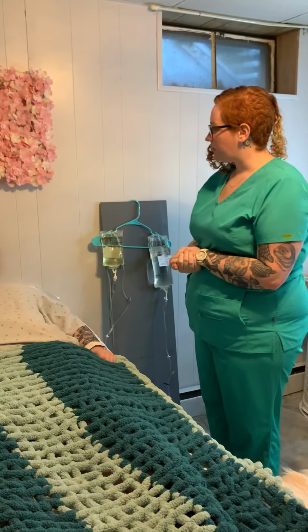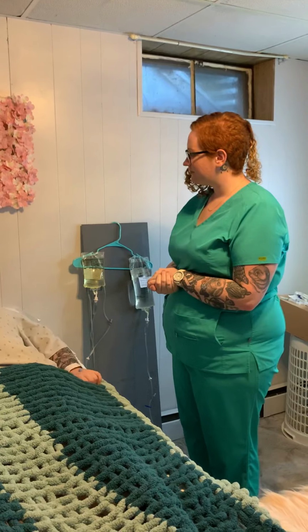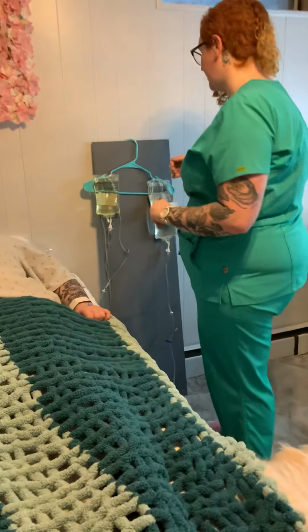Can I have your name and date of birth? Yes. Ruth Peer, 12/20/62. And do you have any allergies? No. Okay, I'm just going to assess your IV and your IV site.